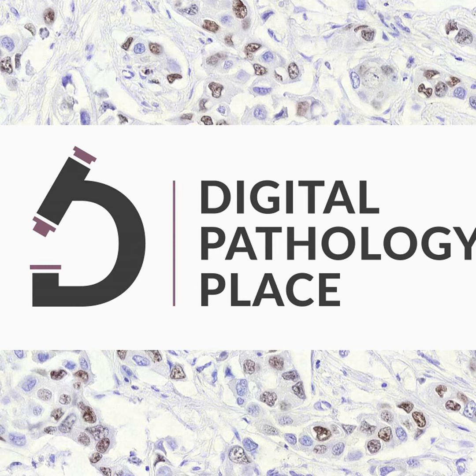And this Federated Tumor Segmentation Challenge represents the paradigm for real-world algorithmic performance evaluation. So what does that mean, federated? Federated is that this algorithm can go to different places where data is available, to different centers, right? And it's just an analogy, but you send the algorithm to learn and bring it back with the weights, with the knowledge. Whereas for the classical way of checking and training is you bring all the data to the algorithm.